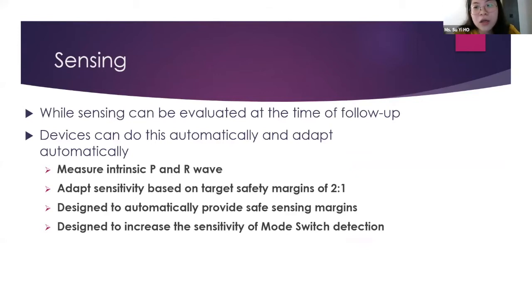Having these intrinsic sensing measures will ensure that there is periodic update and readjustment of the safety margin for fluctuating sensing results, which is actually safer for our patients, because sometimes it will take them about 6 months to 1 year to come for our in-office check. By then, if there's anything wrong in the middle, it'll be too late to simply adjust our sensing value.